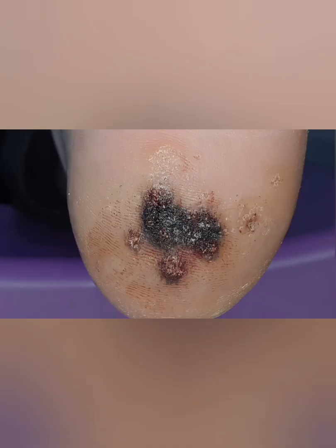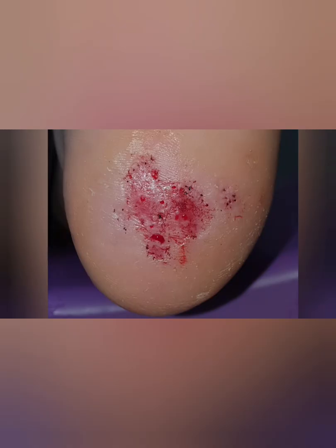So this is 7 to 10 days after. It's like a big scabby area. So basically, I remove that, so it's more comfortable. It's not giving her any real pain now, but I remove that, and then we can see what's going on underneath. So you can see the area's healing beautifully under there. We're still not quite there yet, but it's looking nice and clean. So as far as I'm concerned, that's really encouraging.